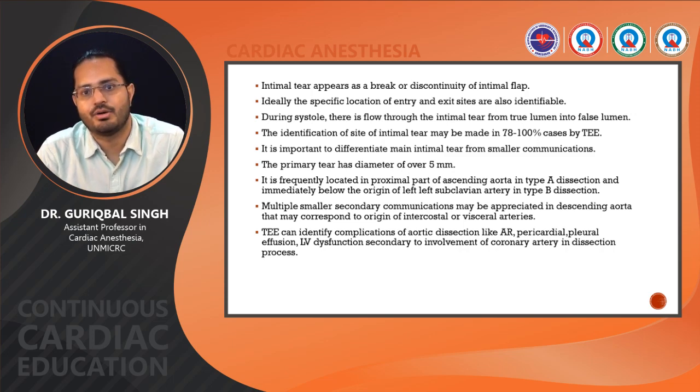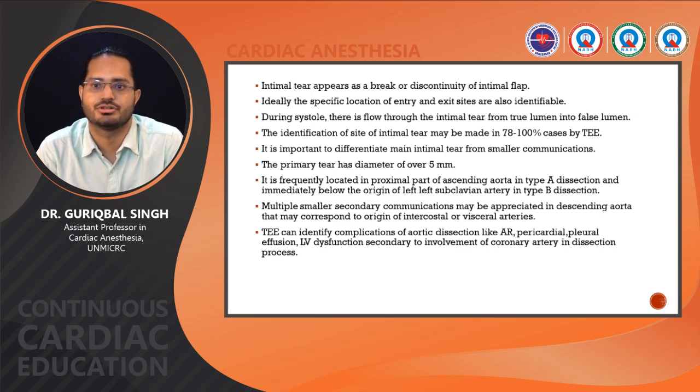TEE can identify complications of aortic dissection like AR, pericardial effusion, pleural effusion, LV dysfunction, secondary to involvement of coronary artery in dissection process.